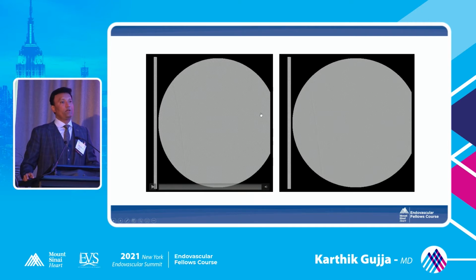It's great. So when to use the filter, when to use what kind of device. So we use a filter for any one vessel runoff. If it's a long CTO, it's a no given, we will use a filter, if you're atherectomizing or ballooning it, if it's calcified. If it's a two vessel runoff and you're not using an atherectomy device, you do not have to use a filter. You can get away without putting a filter if you're ballooning and stenting it. If it's three vessel runoff, it's your choice to do.